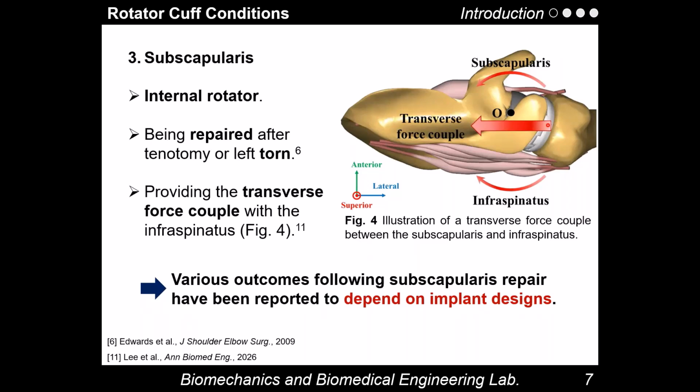In a clinical setting, there is some significant debate regarding the management of this muscle during RTSA. After performing the tenotomy for a surgical approach, the surgeon must decide whether to repair the subscapularis or leave it torn. However, various outcomes following subscapularis repair have been reported to depend on implant design.